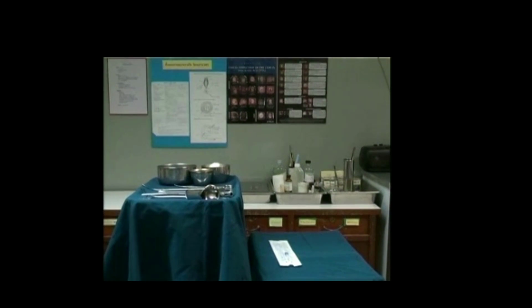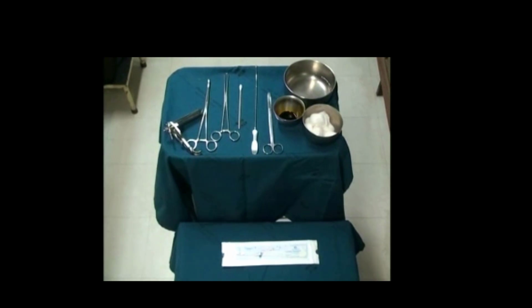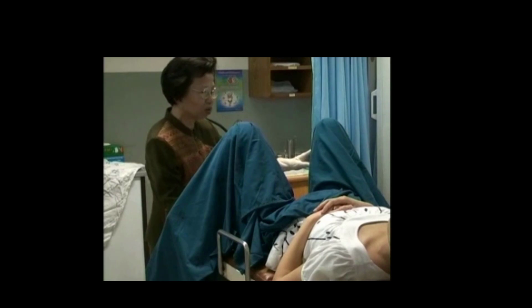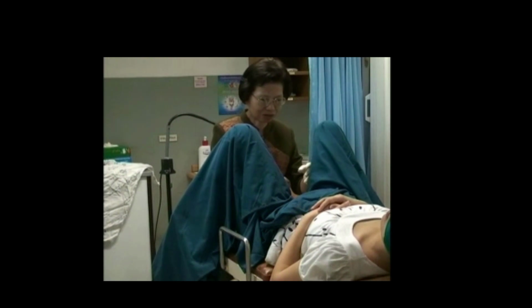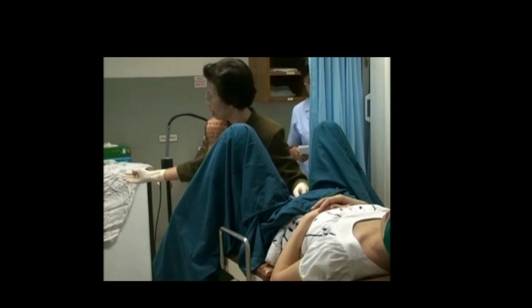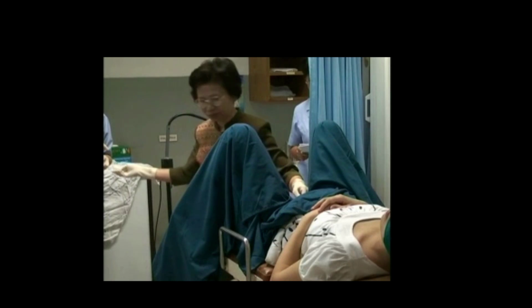Have ready in an easy-to-reach position a vaginal speculum, the IUD to be inserted, and the applicator on a sterile surface. Ensure that the woman is in a comfortable position. You should have already explained the procedure to the woman and responded to her questions and concerns. This helps the woman to relax, making insertion easier and less painful.